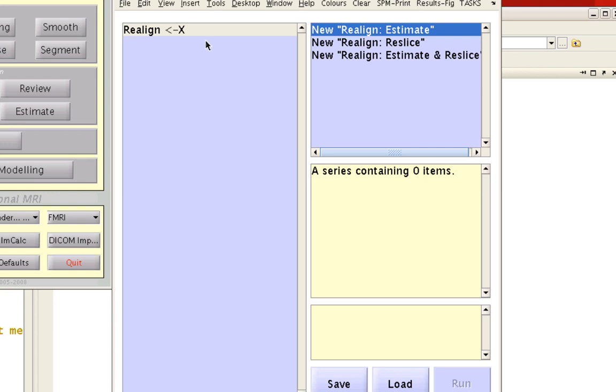Here we have a couple of different options available. One is estimating the motion parameters needed to motion-correct all these different images in case they have moved or gotten out of alignment during the scan.